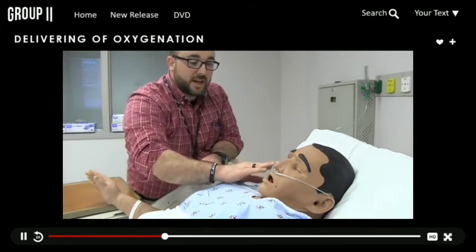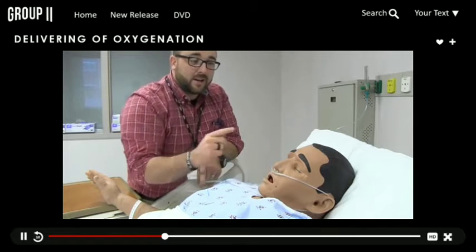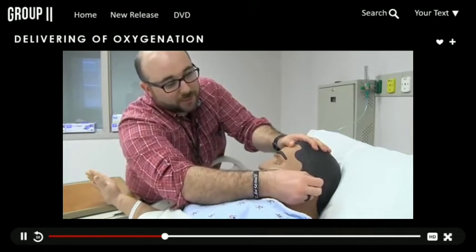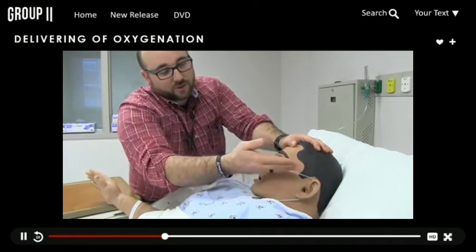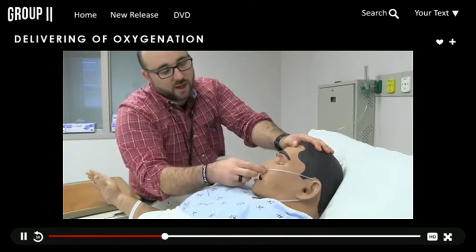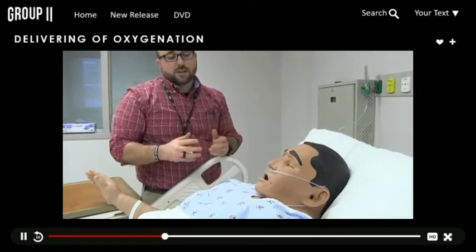A lot of the tubing is now made so that it's soft, because this can cause a lot of breakdown, hospital-acquired pressure ulcers, especially on the tops of the ears. And if it's real tight across the skin right here, of course the skin is very thin, and right under the nose if this is pulled really tight and it's not frequently moved.